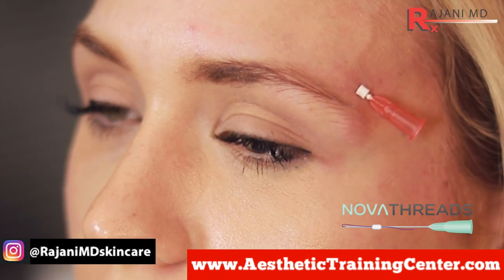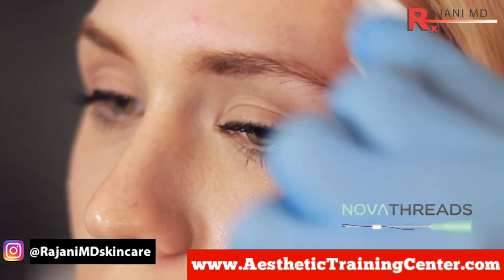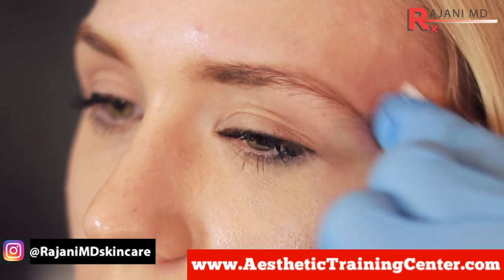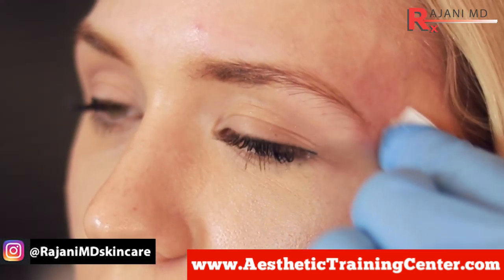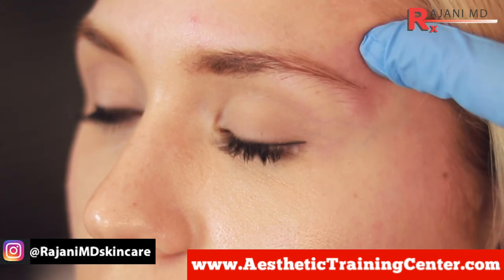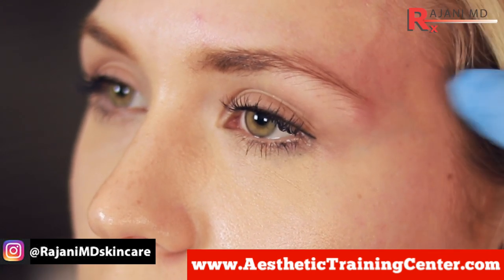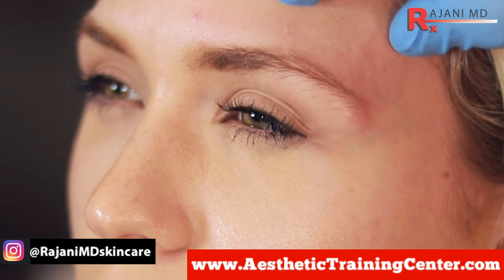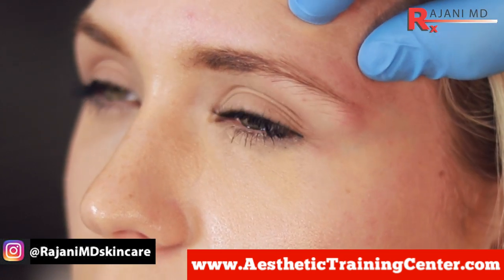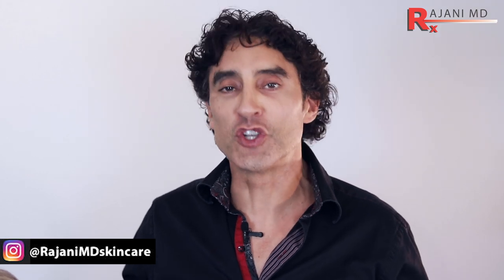But if there is some bleeding, we apply pressure. And when you do that, surprisingly, there's not a lot of bruising — we've managed to miss them. So we did a reasonable job and she won't get a bruise. But every other time they do neuromodulator here, it's really nice to provide a little more lift and collagen stimulation with the threads, because this is the zone we don't want to have to put neuromodulator — anything up here will lower. We never want to lower; we want to lift the tail, but not Spock. So that's a nice combination brow lift using neuromodulator and smooth PDO threads.